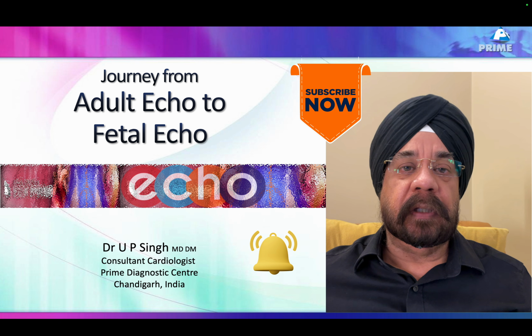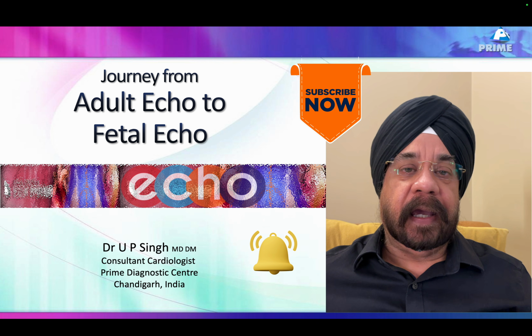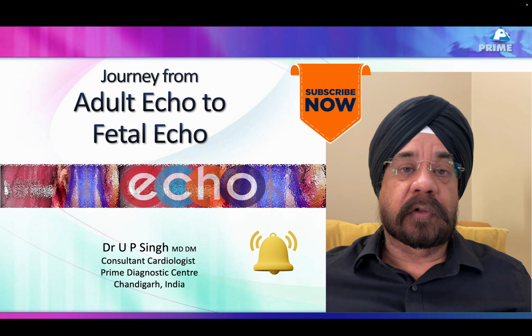If you don't believe me, go through this entire video and I'll step by step tell you the differences between adult and fetal echo and give you cautions where we need to be careful.